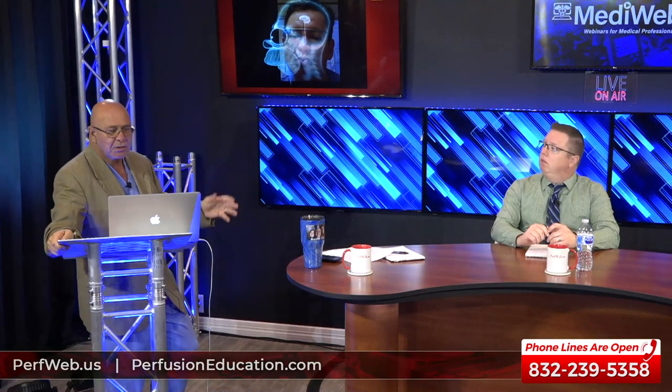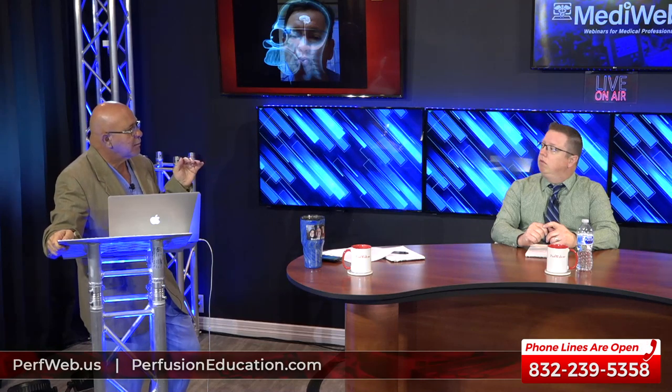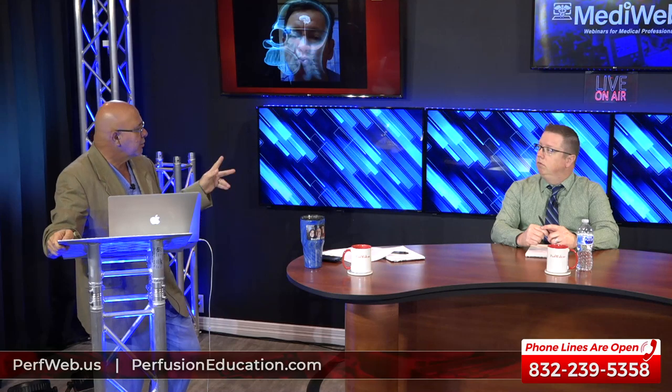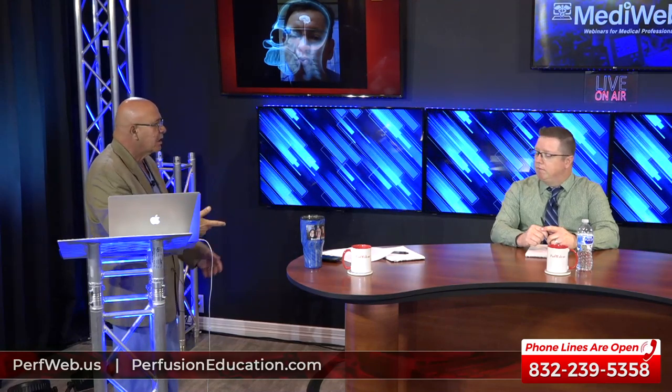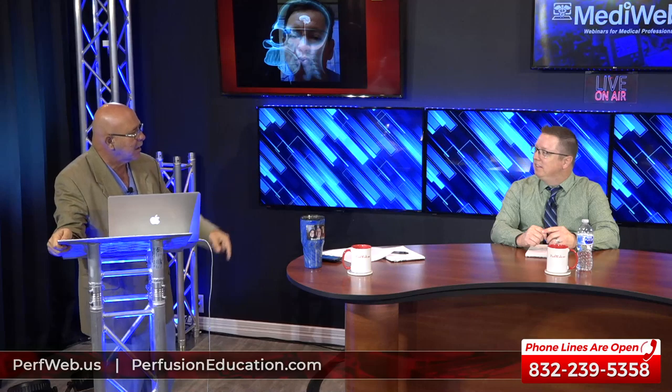Now let me ask you a question. When you're shooting water through a line, and you take a clamp and you're flowing 5 liters a minute of just saline, pumping it out into the air, and you clamp across it, you're not having nice linear flow. What happens to that pressure at the end of the line?